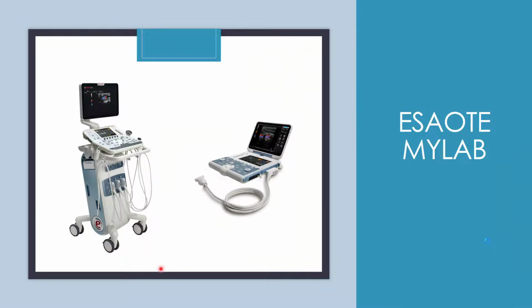Some of the mobile facilities may have more of a Sonosite or MyLab Gamma setup, so it's like a smaller version, like a little laptop, but it's going to be on a cart. But if you're in a brick and mortar facility, you're usually going to have a larger machine to work with. So you'll talk with your nurse supervisor or your RDMS to be able to show you knobology, so where all the buttons are and what they do.